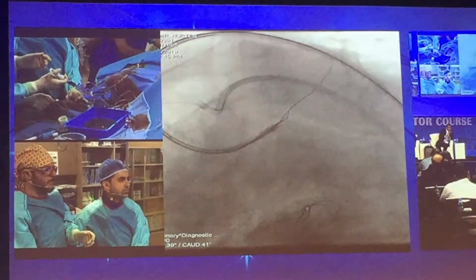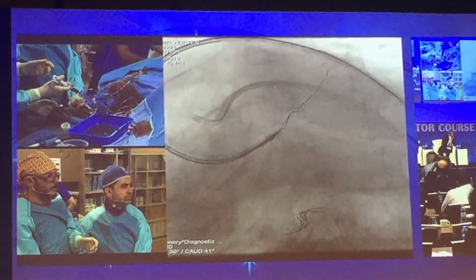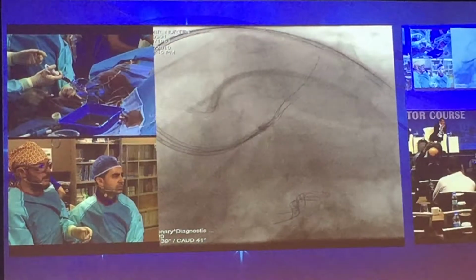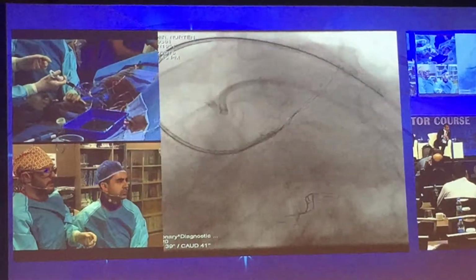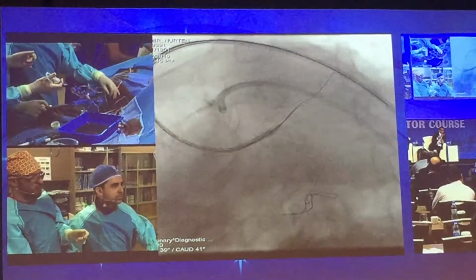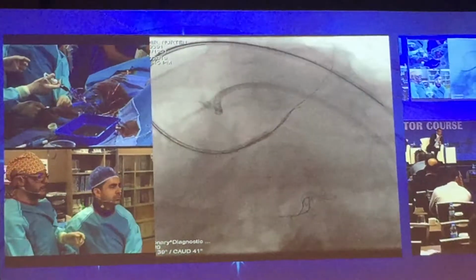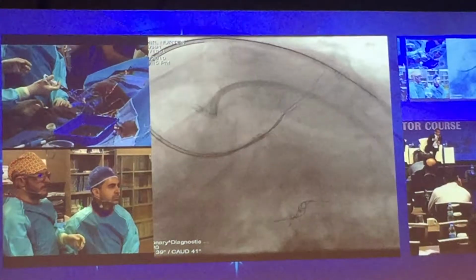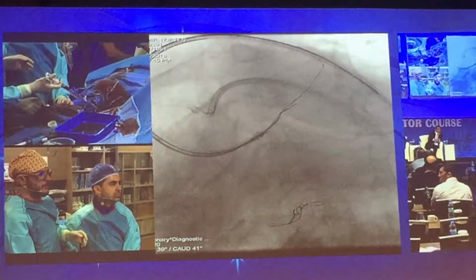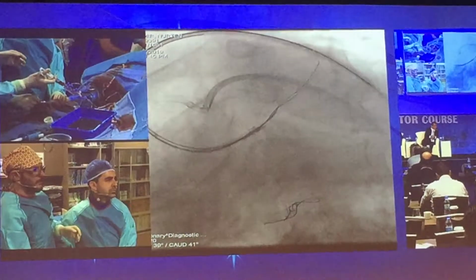I think the parallel wire technique in in-stent restenosis has no great role, because you already have a marker, which is the struts of the stent, and you can direct your wire toward the stent. If you are not able to penetrate the proximal cap with Ultimate Bros or Gaia Third, you can use a Confianza Pro for penetration only, and then advance the microcatheter and exchange it for an intermediate stiffness wire again to cross the total occlusion inside the body of the stent.